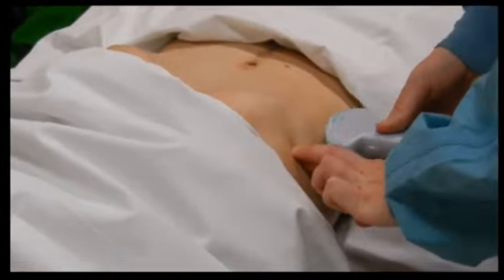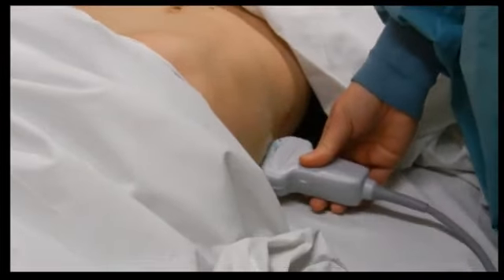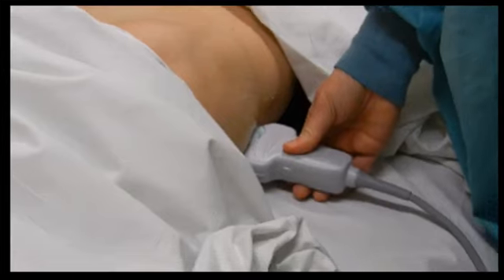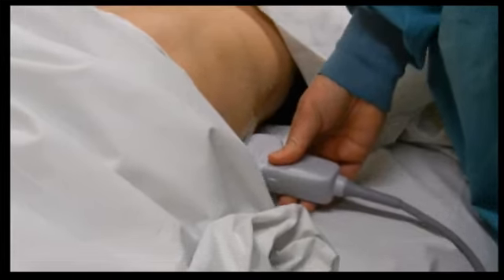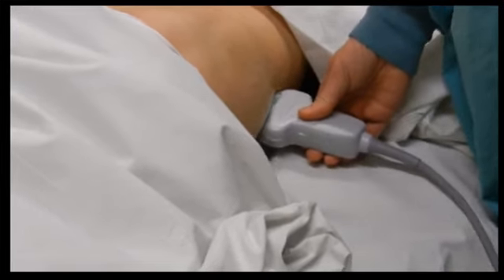To locate the radiographic landmark, the double density of the kidney, move the probe first posteriorly towards the stretcher. Remember, the kidney is a retroperitoneal structure and is most likely more posterior than you think it is. Don't give up until the probe hits the stretcher, or keep going until the probe hits the dirt, as we like to say. If the radiographic landmark is still not identified, then move longitudinally towards the patient's head or feet to try to find the best view of the kidney.